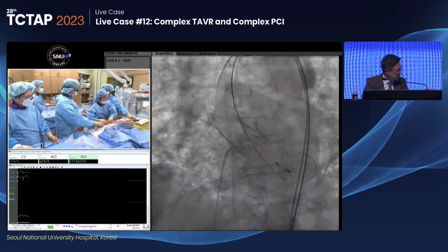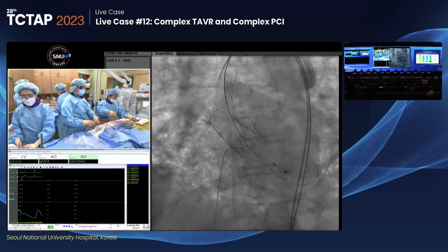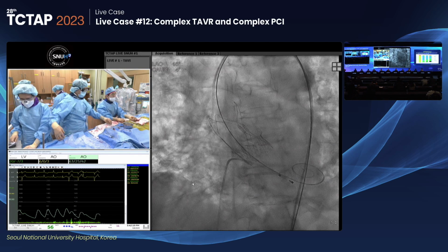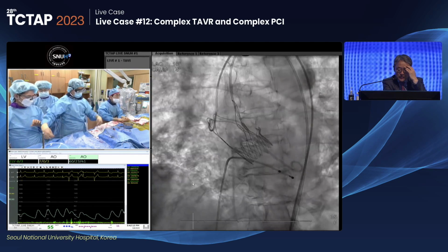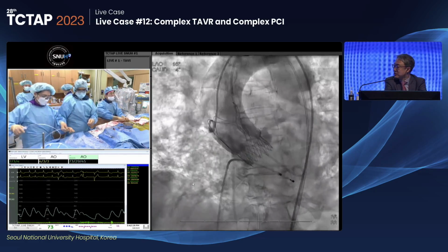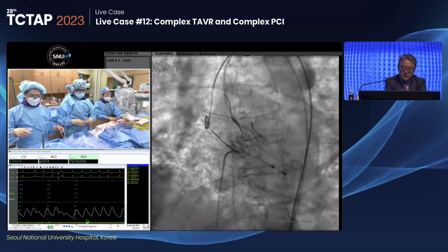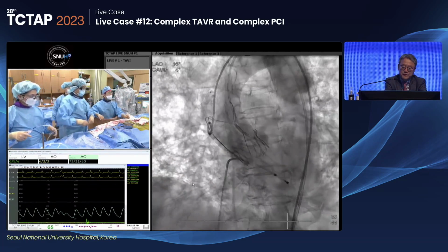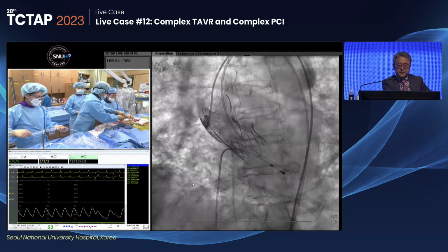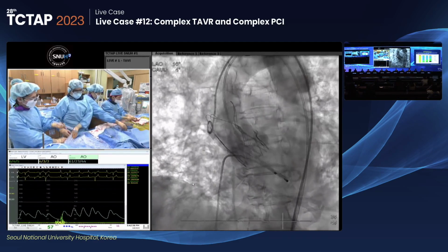So now the crown seems to be touching the STJ. Is there any concern for post-dilatation? The panelist question is, during the post dilation, is there any concern about damage at the sinotubular junction? You can see it there, right? So, but it's a 23. The bottom is supposed to be a 25, but it's hard to know. But just be gentle, I guess. Yeah, I wouldn't expect the top of the frame to grow any with the 23.